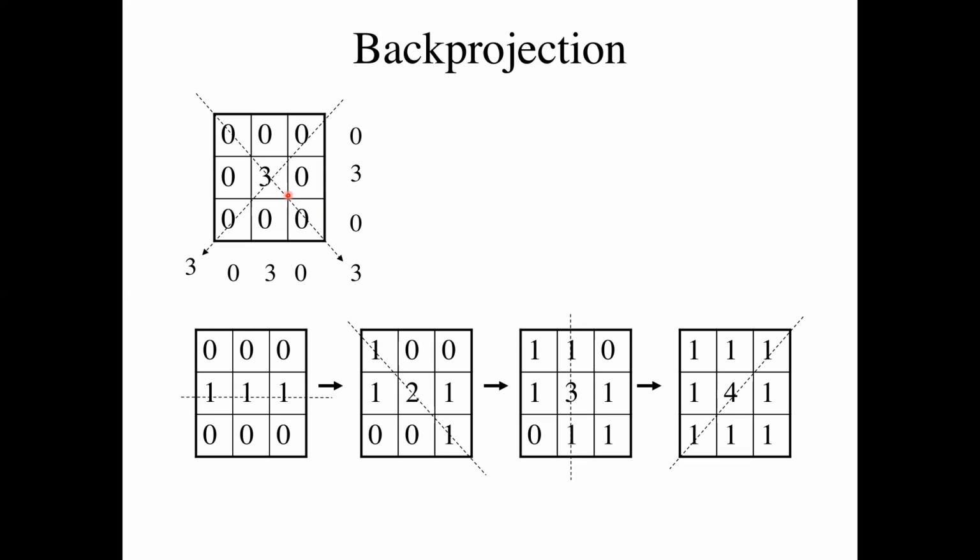I noticed that now it adds to like 5 and 3 instead of 3 and 0. Enough like the sum of the sections. Yes, they are. So this is an excellent point. Here's our first estimate of the picture. And now what could you do? You could take your estimate and project it and see, does that match my data?